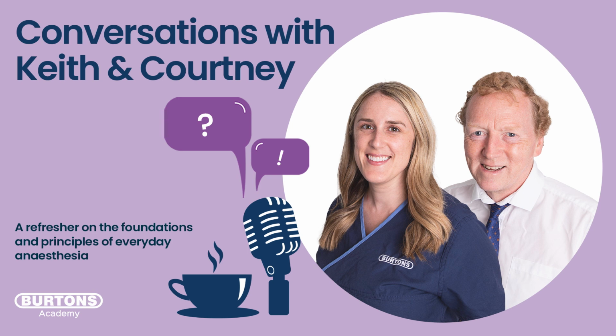But if you could indicate that we'd gone from pause to inspiration, then we'd have actually delineated expiration, pause, and inspiration. And that's what color-coded capnography is about. It tells you what those phases are. And once you start to identify the flow direction of those phases, then you begin to see what's happening. Color-coded capnography will therefore pick up extra dead space immediately.